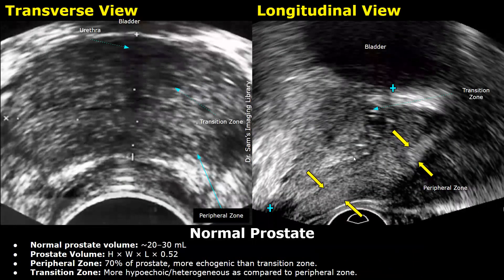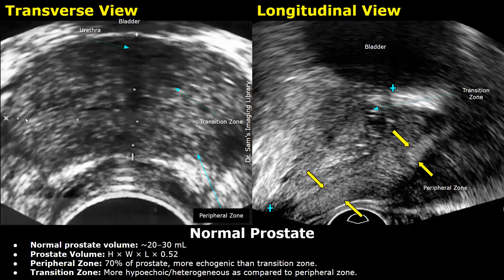Now we will compare the image of the normal prostate with benign prostatic hyperplasia. The normal volume of the prostate should be less than 30 ml. Prostate volume is calculated using the formula: height × width × length × 0.52. The height and width can be measured in the transverse plane, and the length is measured in the longitudinal plane.